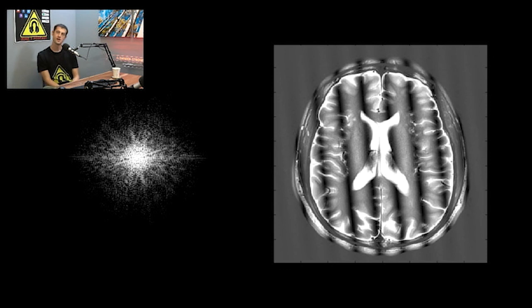And because I made this demo, I can tell you what it is. But if I was encountering this, I would know it's towards the center. The center of this Kspace is lower spatial frequencies and the edge is higher spatial frequencies. And it'll start making sense as we go through this. I put that really white pixel here.